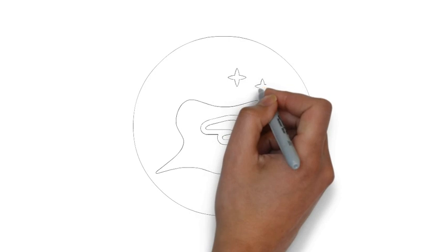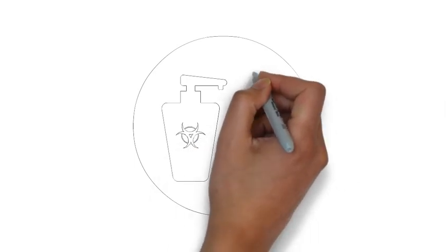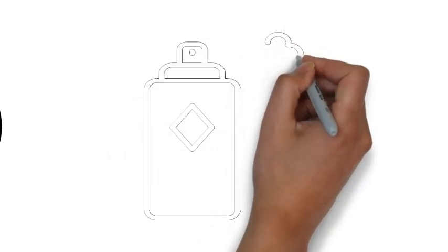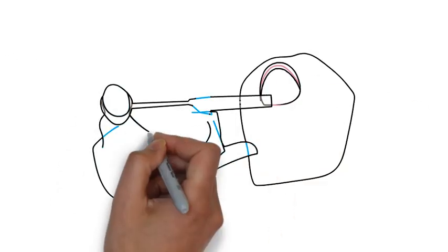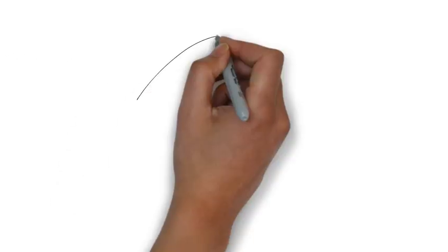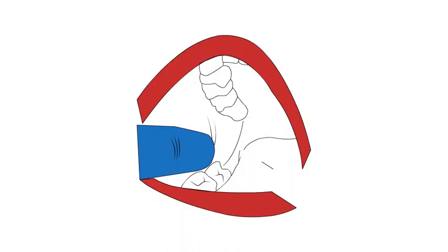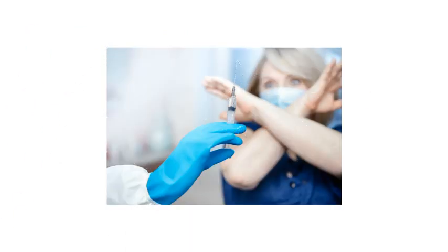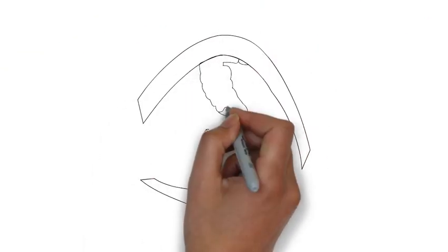Then the tissue should be dried to help in retraction. Then apply topical antiseptic, but it is optional. After that, apply topical anesthetics for about 2 minutes and at the same time communicate with the patient. Establish firm hand rest and keep the tissue taut to avoid mishandling and allow the needle to easily and smoothly cut through the tissue. By keeping the syringe out of the patient's line of sight, insert the needle into the mucosa while communicating with the patient.